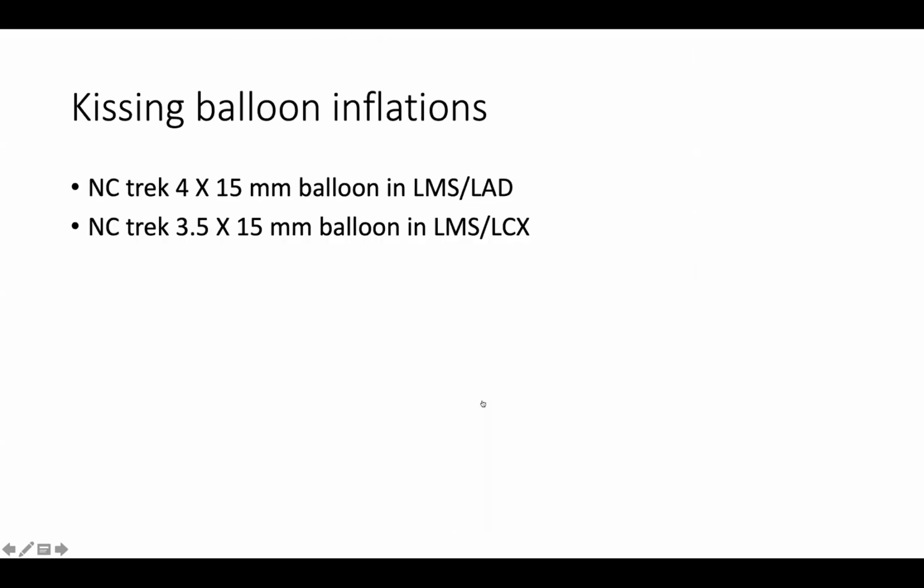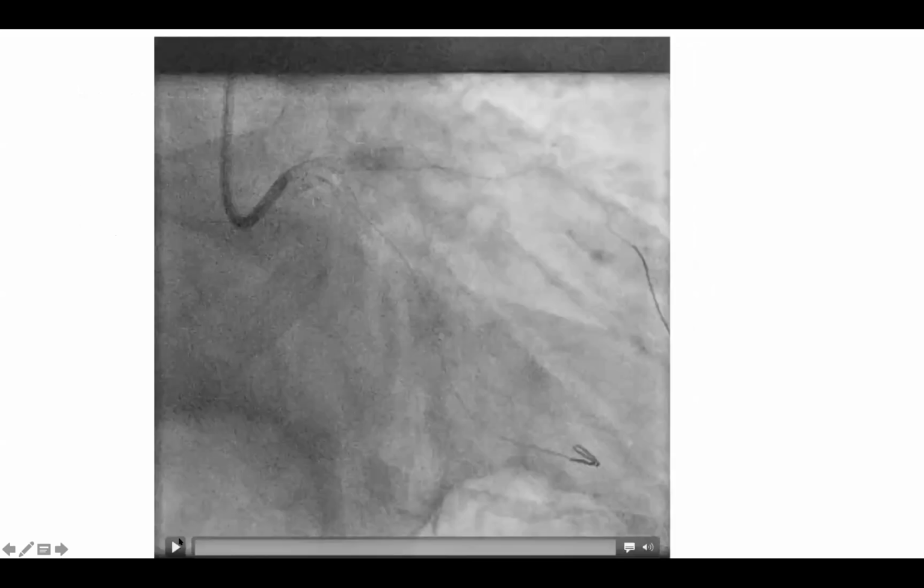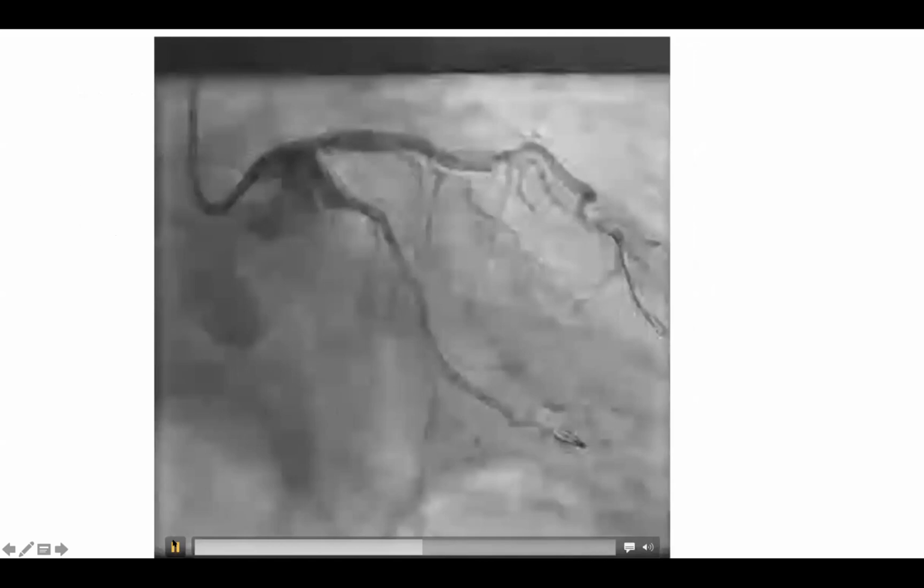Tariq, would you give any tips to the trainees when they're doing the kissing as to where the marker should be? I think they should match, in my view, basically the proximal marker if we can.